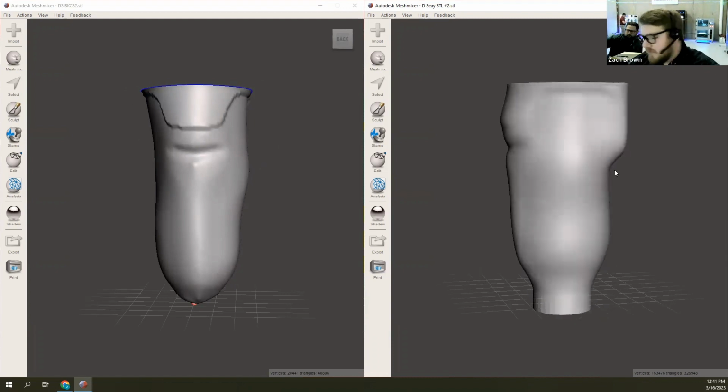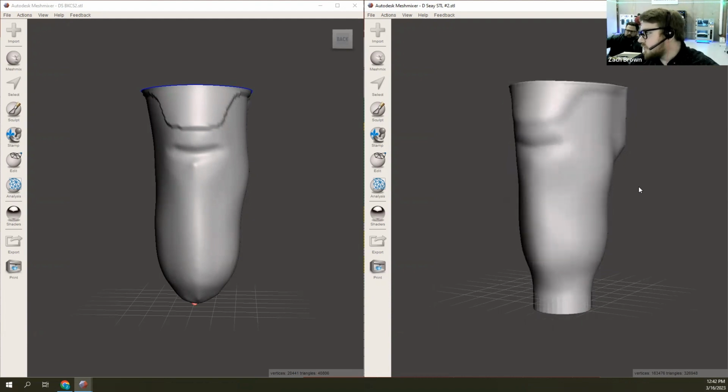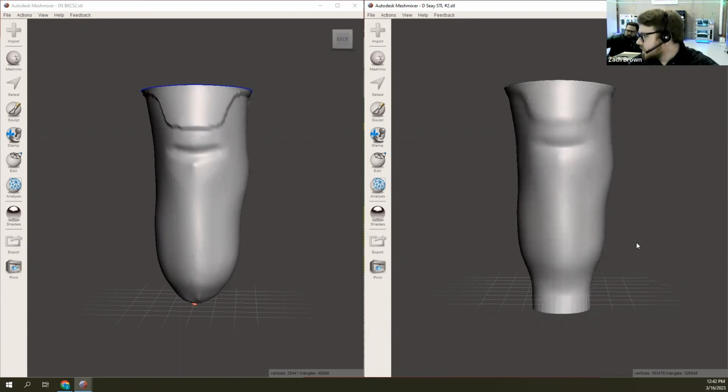Sometimes with a highly active patient or a patient that's exceeding around 200 to 220 pounds, we'll add in a little bit of distal reinforcement with 8 struts at the bottom going into the distal area, which doesn't cause any discomfort. It's actually a nice little strength for the socket in general. From there, we'll slice in our software so we can put it onto the printers. And then after printing, we'll come out with this product right here.